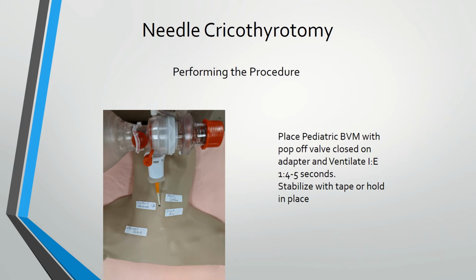We want to take that BVM and place it over that 3.0 ET adapter. That's why we use it, because any BVM will fit it. I like teaching to use a pediatric BVM because you have a pop-off valve that you have to override. As you can see on that BVM, you should be able to see my cursor, the white override, I've locked it over to pop off, so that the pop-off valve won't be in play, and you'll be able to get a little more force.